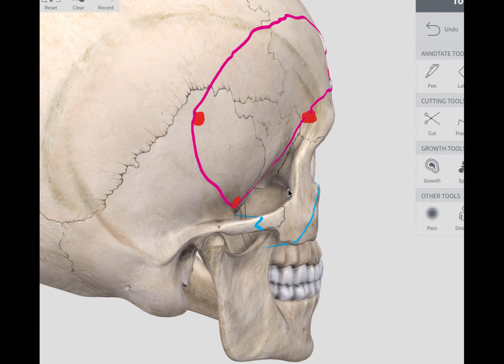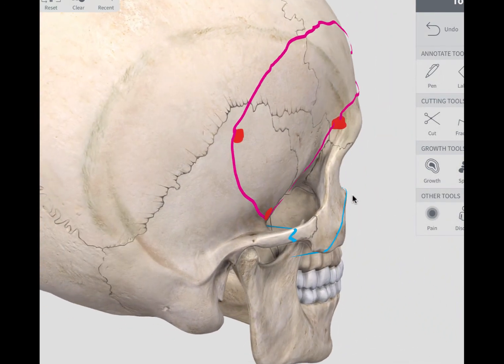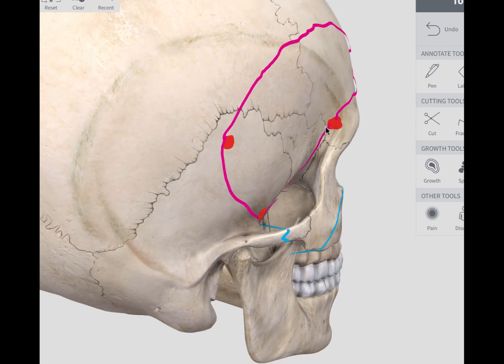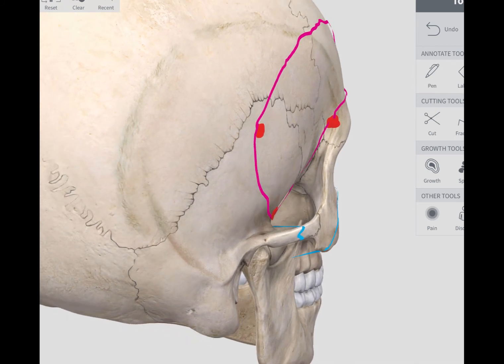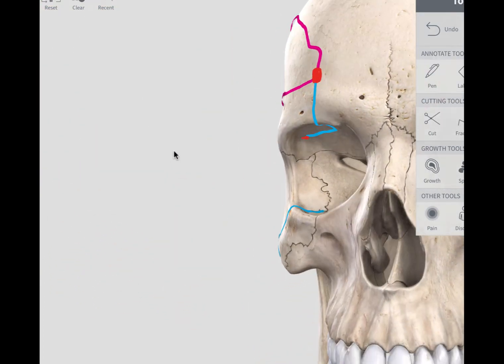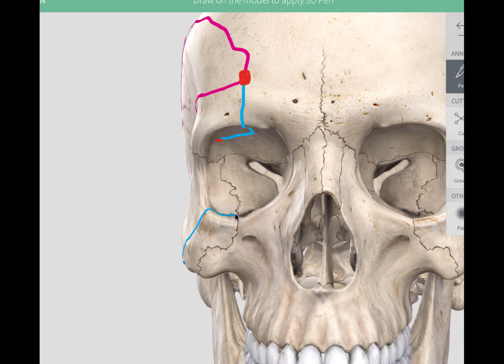The sixth and last cut extends from the inferior orbital fissure to the keyhole burr hole made earlier. This is essentially a cut on the lateral wall of the orbit. If you look inside the orbit, that cut goes from the inferior orbital fissure to the keyhole burr hole.